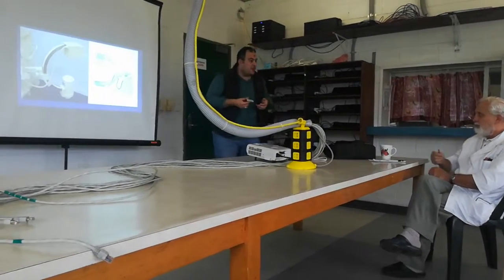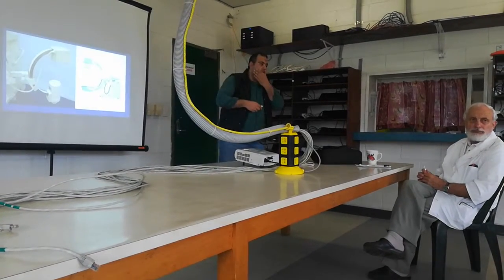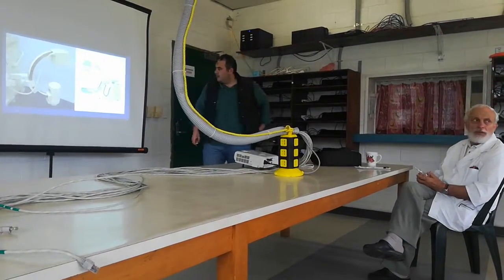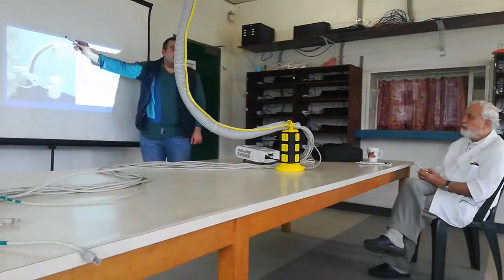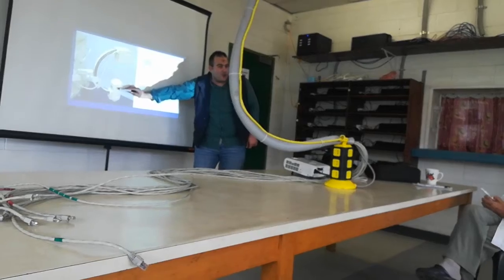Reflected radiation. Do you understand where next to the tube is? All of you understand? Point on the image to show where is the side and where is next to. This is the X-ray tube, and this is the intensifier. You have to be on this side, not on the side of the X-ray tube.